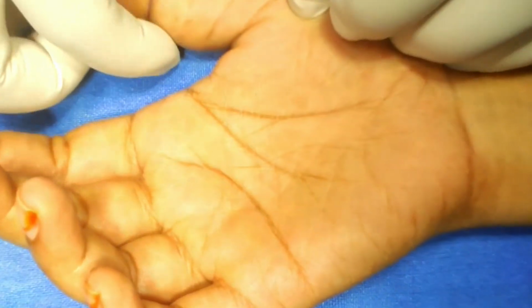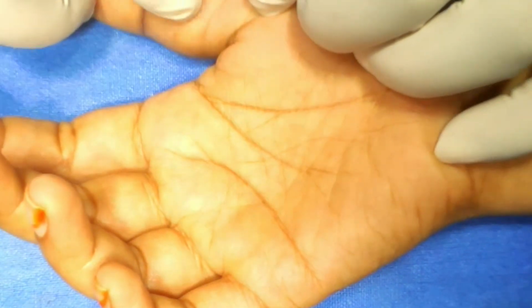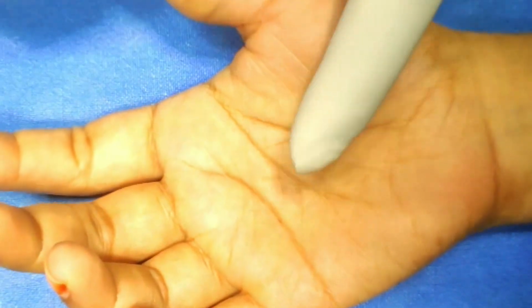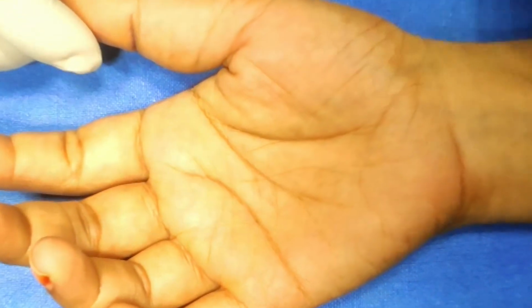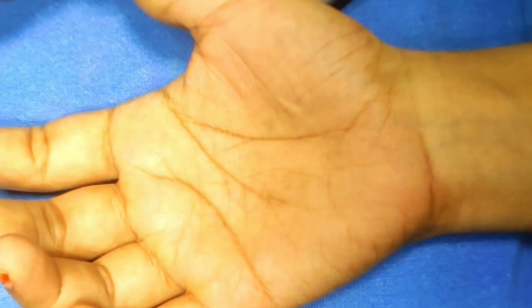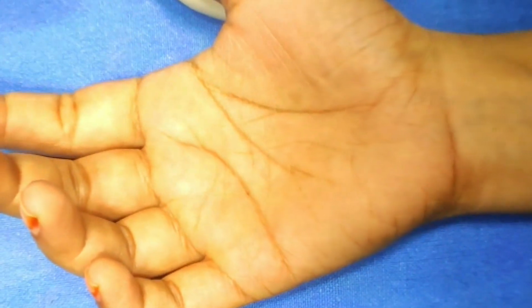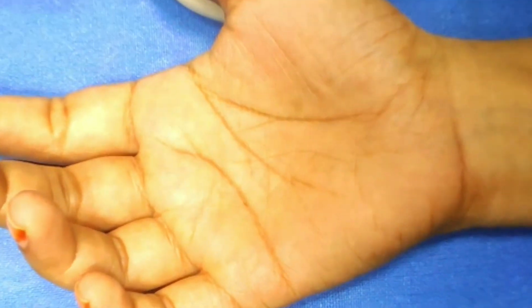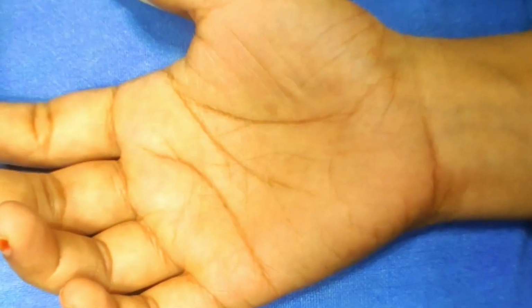Now you can notice the mass in the proximal phalanx of the thumb and multiple prick holes made by the surgeon previously. The important thing is, after applying a tourniquet, I keep the tourniquet 60 mm of mercury above the systolic BP of the patient. Exposure must be appropriate. If you make an incomplete or inadequate exposure, sometimes you cannot remove all the lesion, because this is an aggressive, localized tumor, and recurrence is very high.